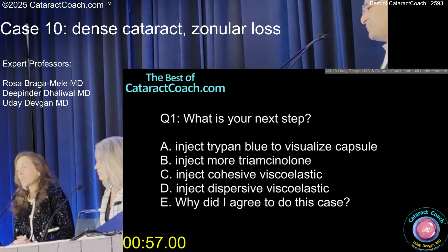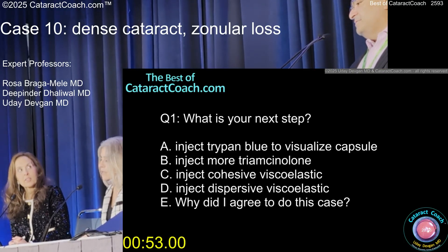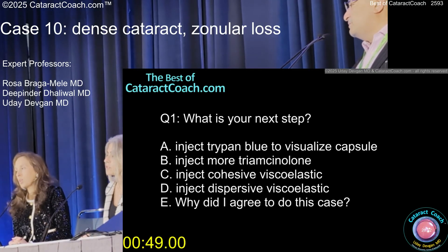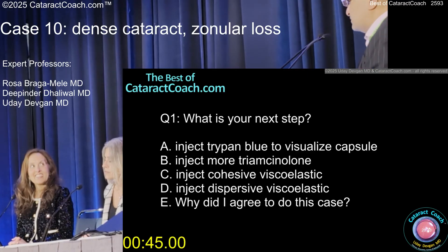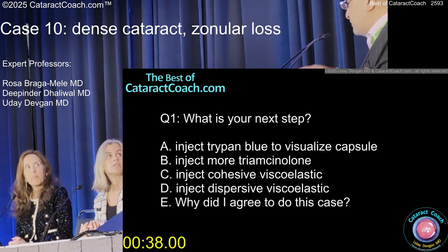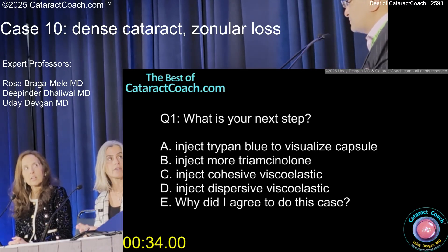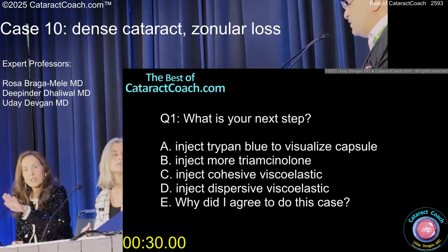If there's no vitreous and the trypan is done, inject viscoelastic and then put trypan underneath — paint it. Which viscoelastic do you want, dispersive or cohesive? Dispersive. How much do you inject in that gap? I don't inject into the gap — I just inject over the AC, like your regular AC fill. Maybe a little extra viscoelastic over the gap to make sure everything's okay, but not going behind it.